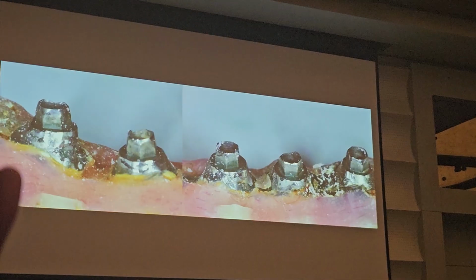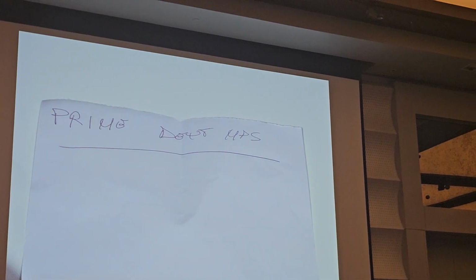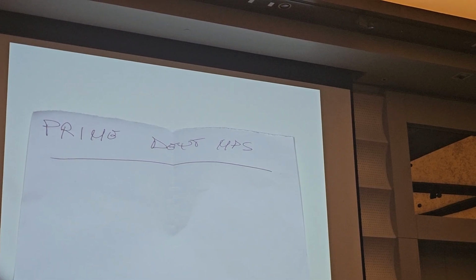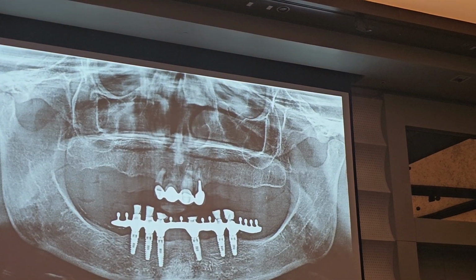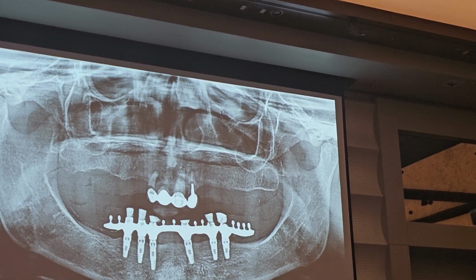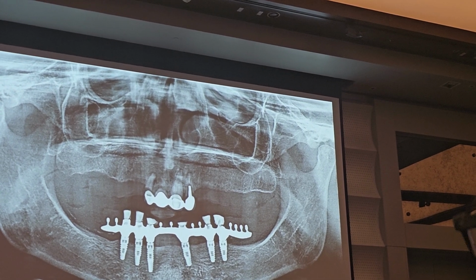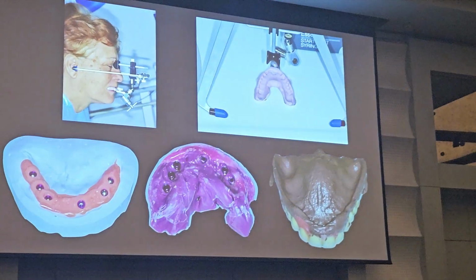Anyway, I redid the prosthesis. This was the bad prosthesis that I did. The patient came just with this indication of the implants, and this is what the dentist gave her. Look at the passivity. Anyway, this prosthesis, with zero passivity and that hygienic design, stayed in the mouth for 8 years. Anyway, we did the treatments completely over, also the upper arch.